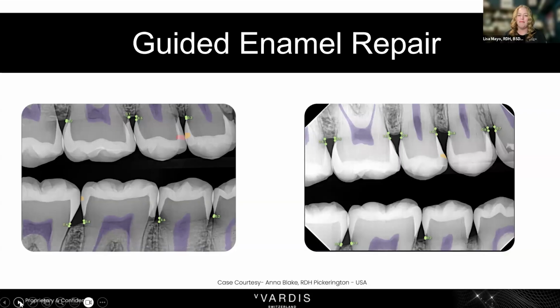Well, this patient doesn't have bone loss. This is an adolescent. What the dentist diagnosed, looking at teeth with the AI off, with the AI on, you can clearly see the lesions here on the left-hand side of the screen. Number 4 was diagnosed as an E2 to a D1 lesion, which means that lesion has full enamel penetration and possibly a transition through the DEJ into the outer layer of dentin. Number 5, distal, is an E2, which means more than 50% penetration into the enamel of demineralization. And don't forget to look at the distal of number 30. That was an E1 lesion, which is isolated to the outer half of enamel.